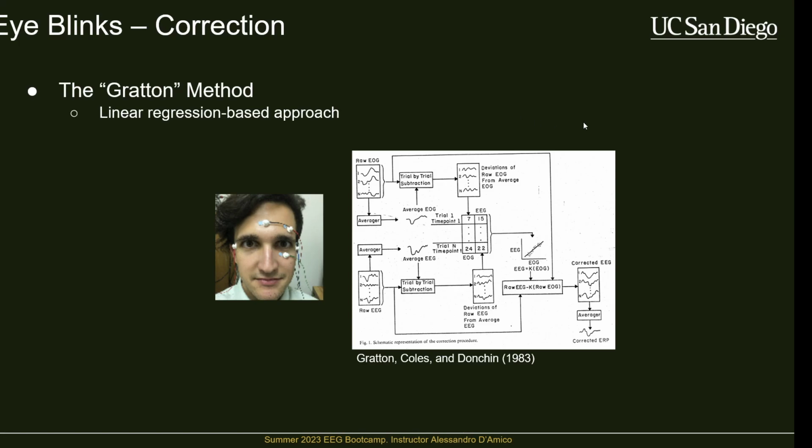And the drawback is that although the EOG electrodes are mainly picking up your eye activity, they're also going to be picking up some EEG activity. It's not going to be a lot because you're pretty far from the regions of the brain you're interested in, but the distance from FP1 to the first EOG is like nothing. So when you're regressing out the EOG signals, you're mostly removing the blinks, but you're also going to be removing some EEG activity from your signal. It's always going to be a balance of methods. You're never going to be able to perfectly isolate your signal from your artifacts, just because there's always going to be some mixing involved with them.